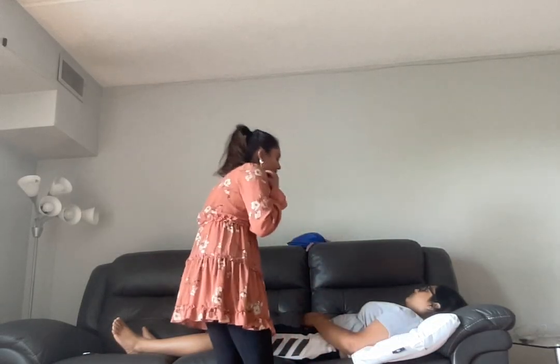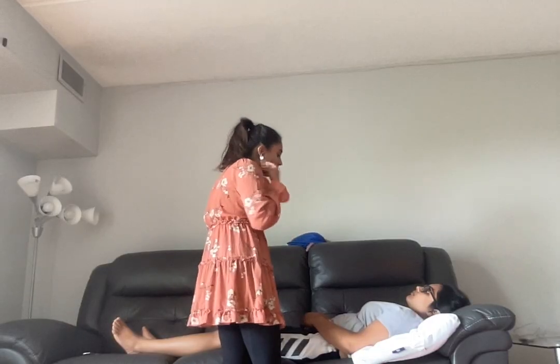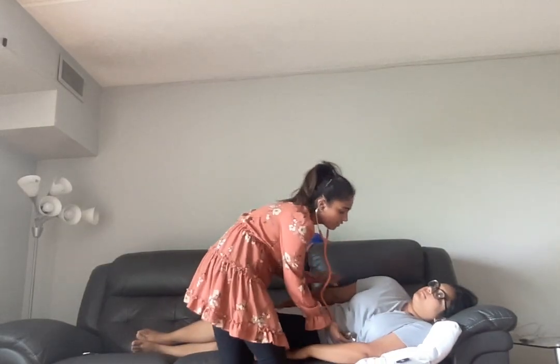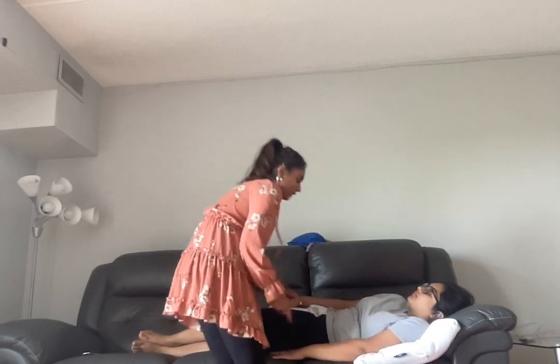All right, now I am going to listen for mitral stenosis. I want you to turn onto your left lateral decubitus position just a little bit. Perfect. Okay, no mitral stenosis audible.